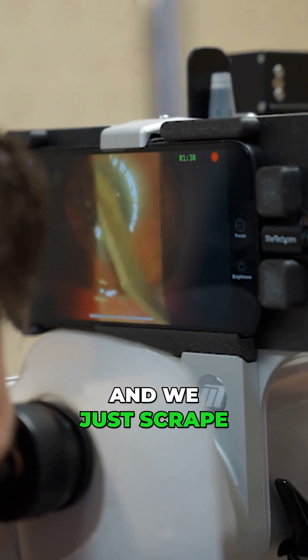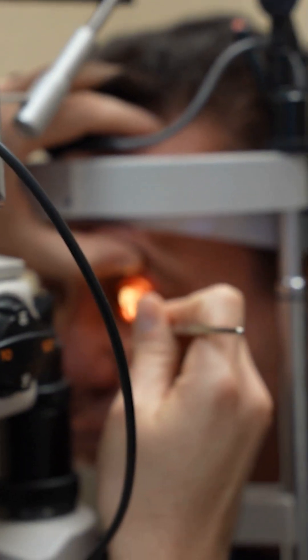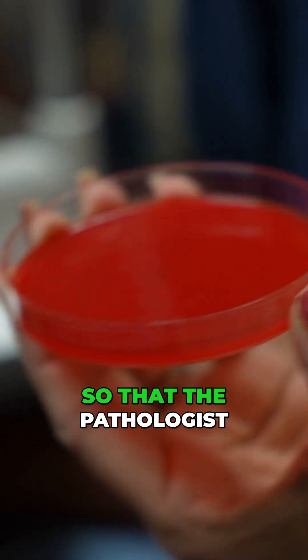And we just scrape. Removing epithelium is actually a good thing — it helps expose the area for the antibiotic. We make a little C pattern so that the pathologist can know that it's corneal tissue.